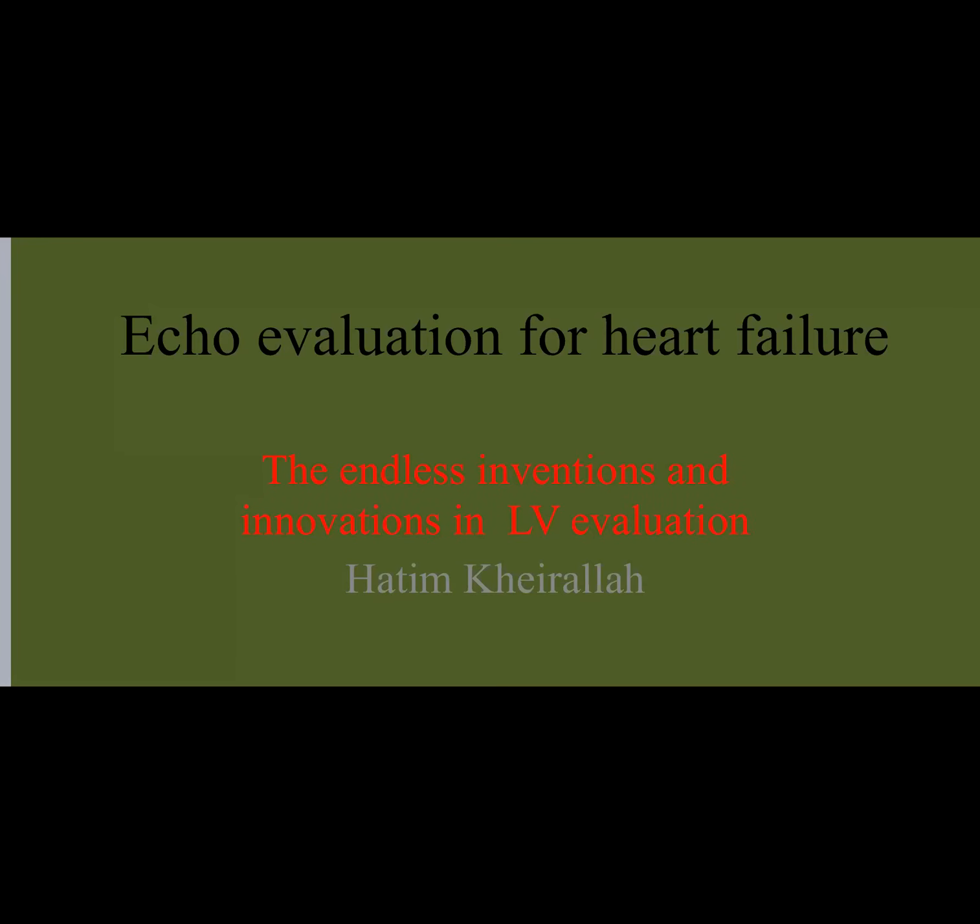Because it's good that even the things we don't know and don't practice, you have to know them. Okay, so you always have to be abreast of the new technologies, the new ways of doing measurement, even if you don't do them, because some of these things we also don't do here. But we know we are going to incorporate this measurement in the near future.